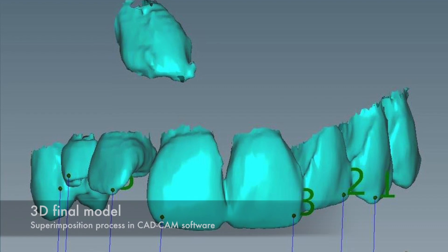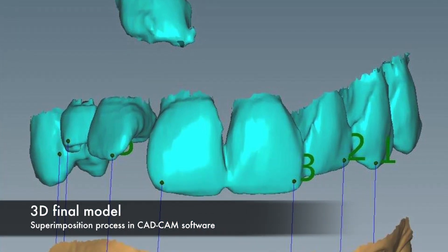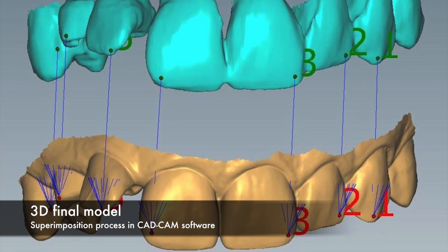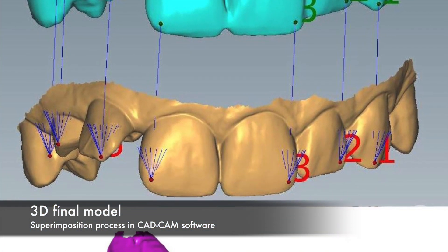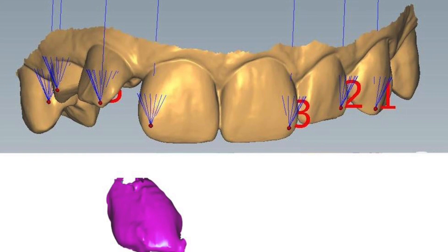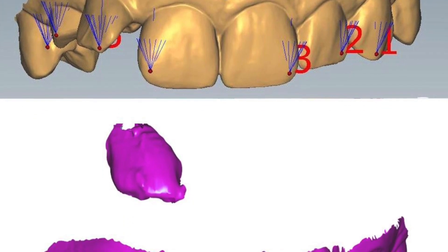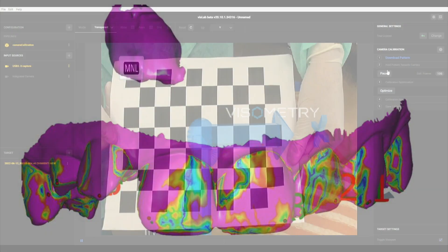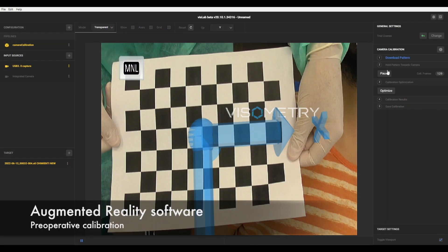A 3D model is created by combining the anterior teeth taken from the intraoral scan with the same teeth plus the included tooth taken from the CBCT segmentation.